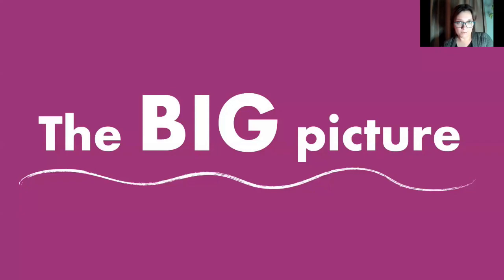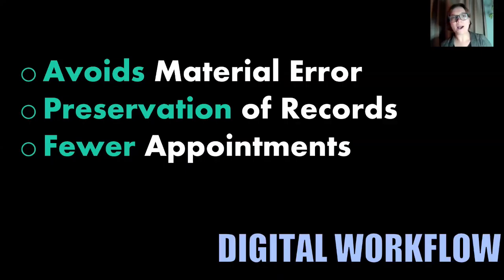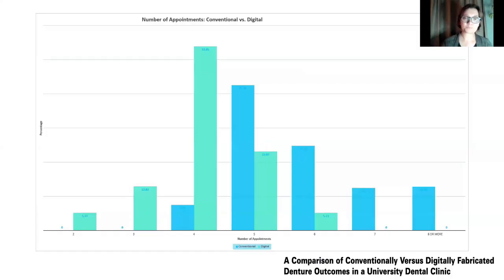So let's wrap this up with a big picture. Why are digital dentures becoming so popular and having so many webinars and so many CE courses at the big meetings? There's a lot of benefits we went over today. They avoid some of the material error we see with conventional processing. We preserve the records from start to finish, from the primary impression to the final denture, and the workflow's consolidated.